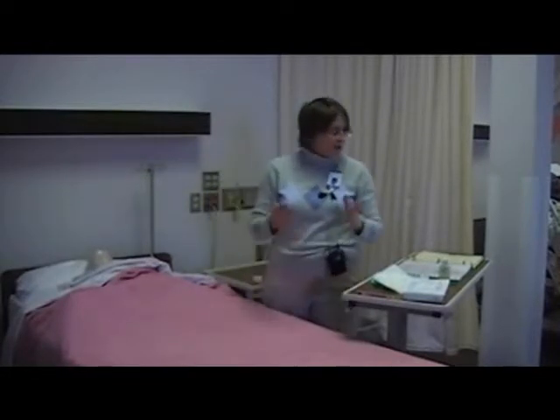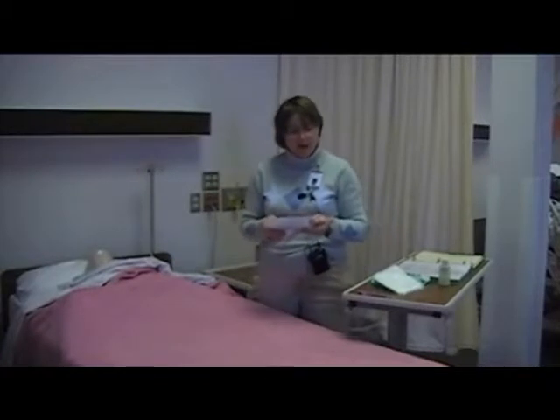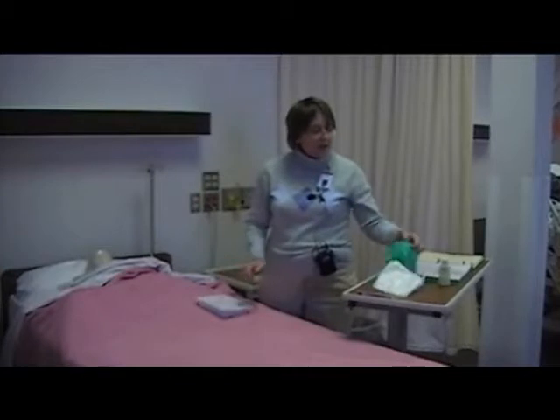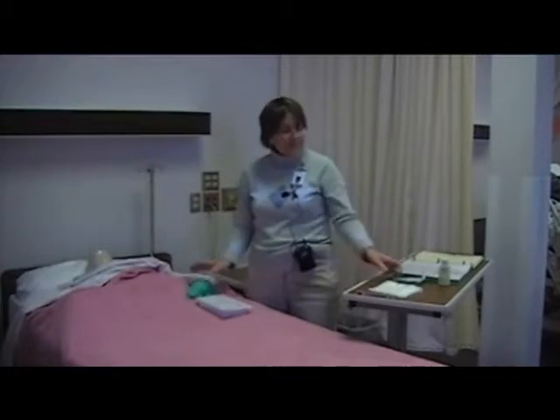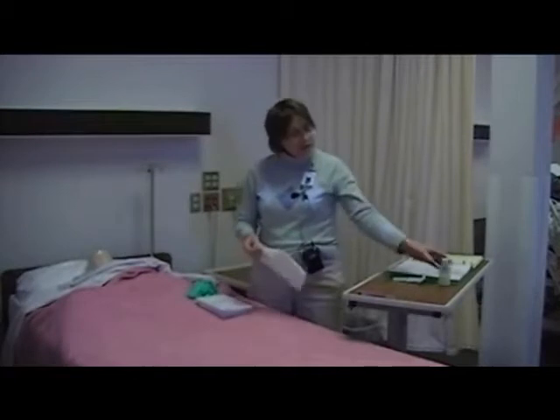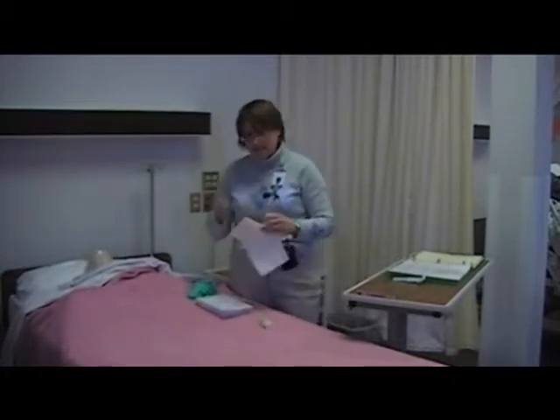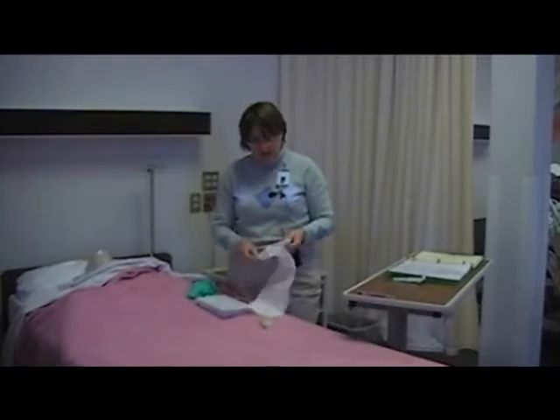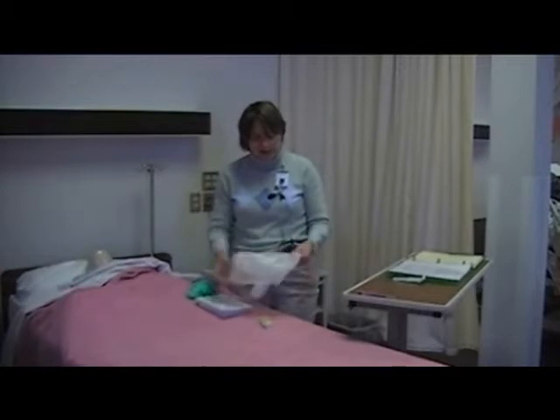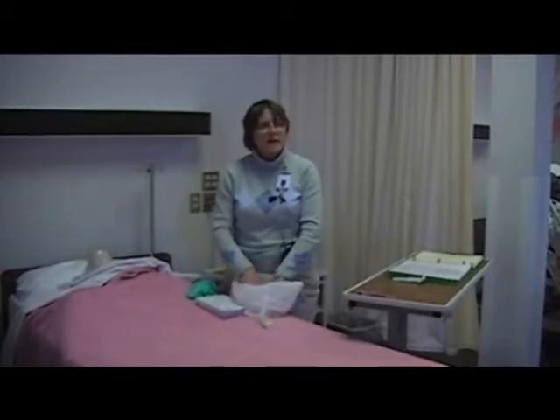Okay? So I'm going to gather the supplies I need. I'm going to need my dressing kit. I've already reviewed the contents and I know what is in it. And I also know that I'm going to need a pair of clean gloves and a bag for disposing. I'm also going to have my bottle of instant hand sanitizer there. However, if your patient has C. diff at all, the alcohol-based gels do not do anything for C. diff.